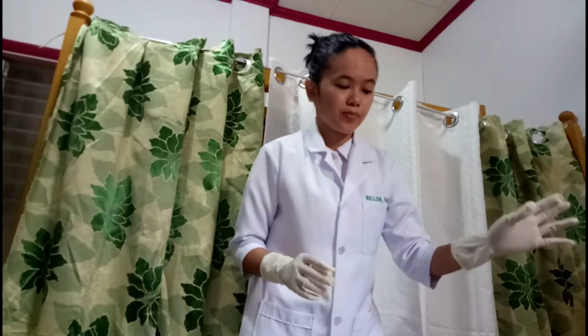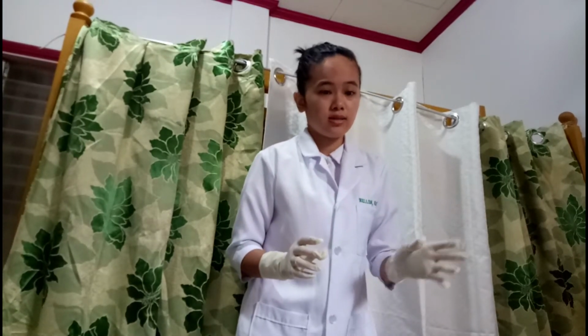So as you can see, I securely attach the tape to the leg of the patient so that the catheter is secured when the patient moves, it isn't hard for him to move, and also to prevent infection or retention or any injuries related to catheterization.